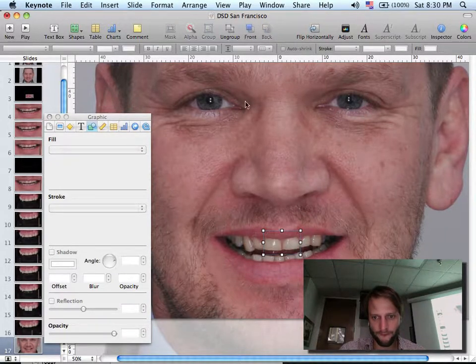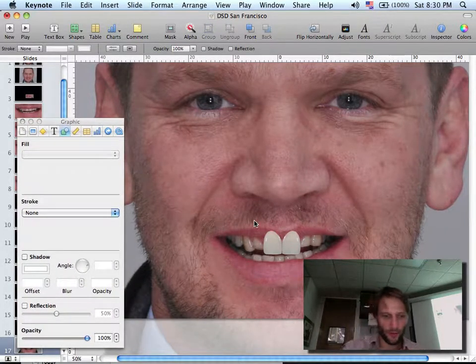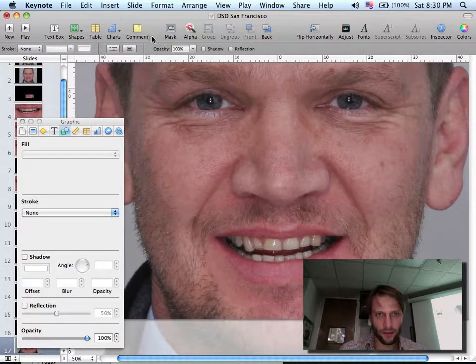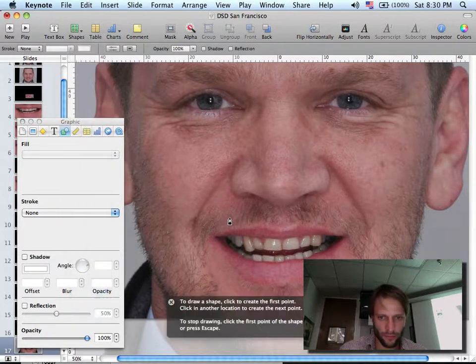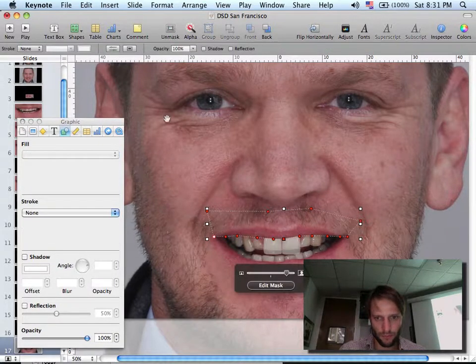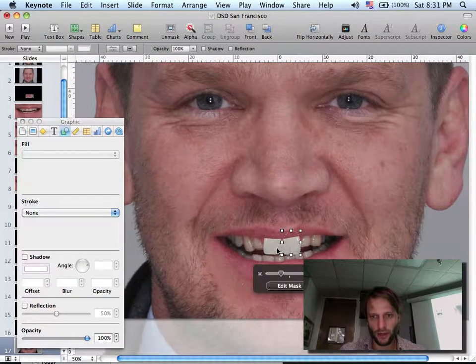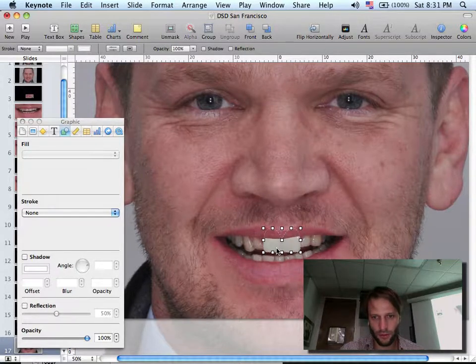Now, oops. Now, what do we do with the lips? What we can do with the lips is this. Very, very simple. I can crop the lip the same way I crop the tooth. I can crop the lip. I can make a floating lip. And now the lip is on top of the veneers. So you can actually intrude or extrude.